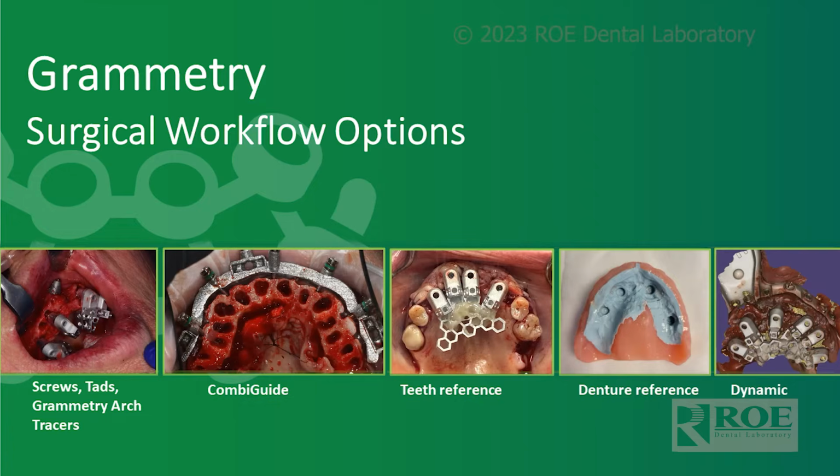Whenever you go through one of these processes during the surgery, where this is a surgical workflow, right? When you go through the process, you have to preserve the bite, okay? Because in surgery, the patient loses their teeth, and you need to have records before surgery and records after surgery that maintain the bite. Now, how do you do that when the teeth are gone? Well, let's go through that process.